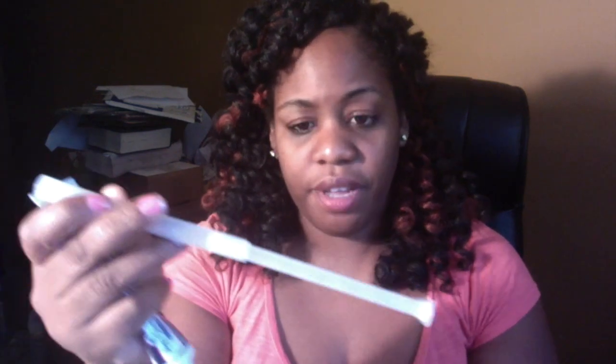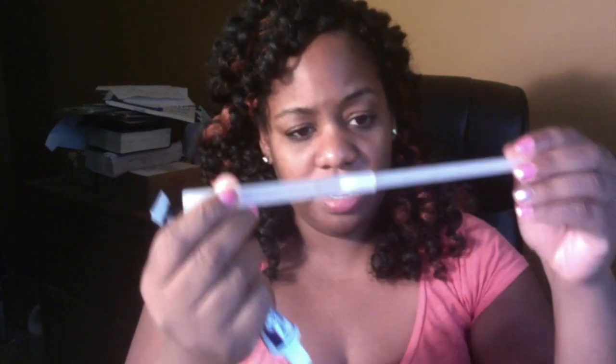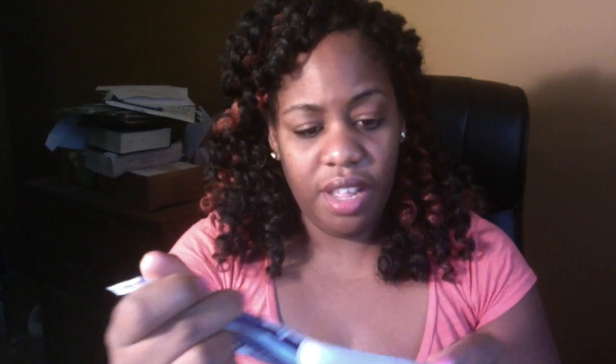And also what I did for this cycle as well, I purchased something from Walgreens. It's called Pre-Seed. And this is the Pre-Seed, and it actually came with 6 applicators. And basically, the way I use it, I can show you the applicator. So these are the applicators. It's kind of like a little plunger. And it says that you should use about a gram.